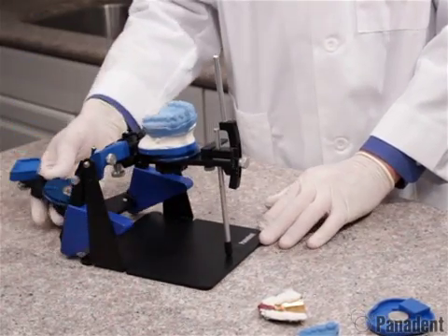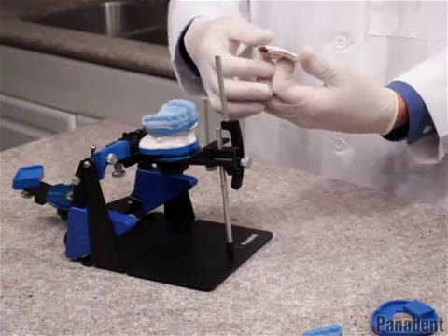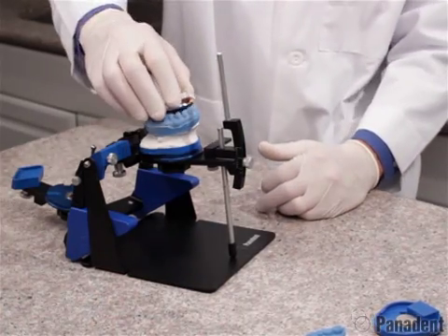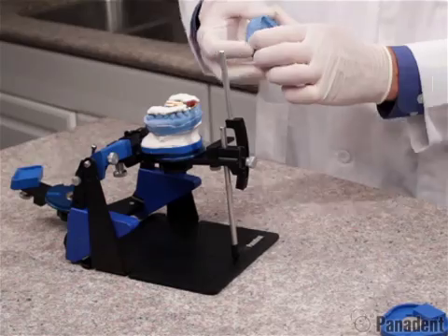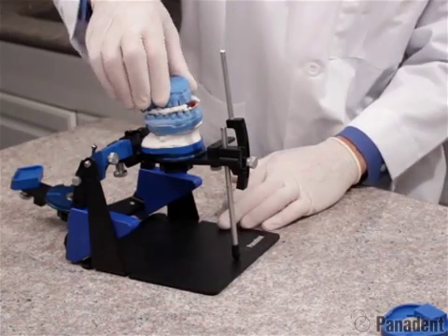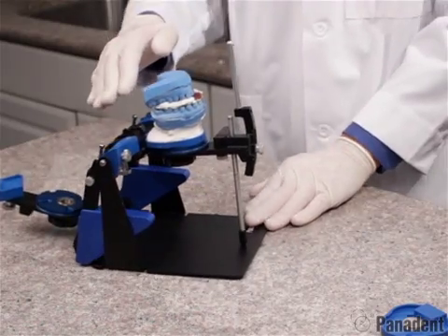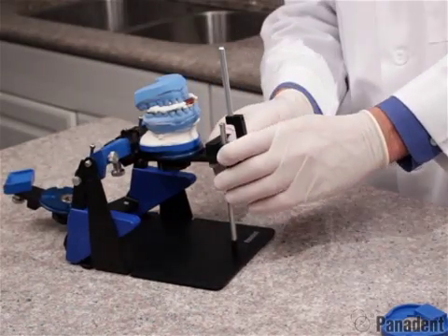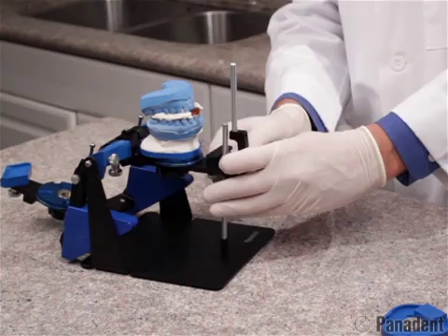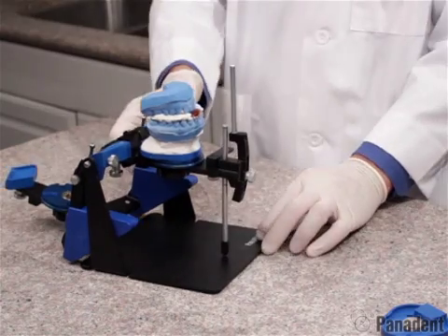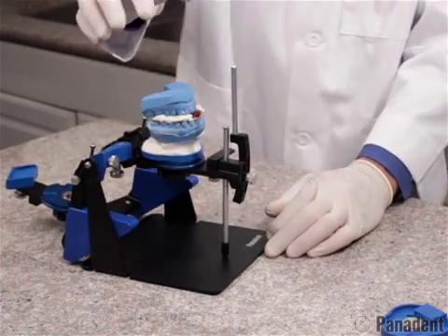And then rotate the lower frame back in preparation for adding the centric relation record to our maxillary cast. And then we can add our mandibular cast into the interocclusal record. Many times you have a curve of Spee here where the casts are canted downward. And so we can actually adjust the front of the articulator down to level that cast so the plaster will stay in place during the mandibular mounting procedures.